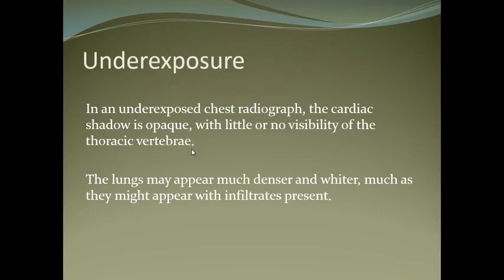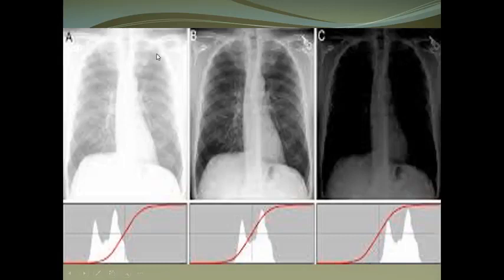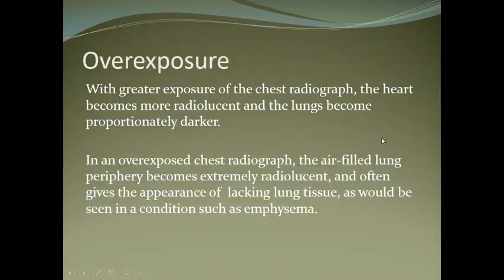In an under-exposed chest radiograph, the cardiac shadow is opaque and the thoracic vertebrae are not visible. The lungs may appear much denser and whiter and might be misinterpreted as infiltrates. You can see: this is the normal chest X-ray, this is under-exposed, and this is over-exposed.